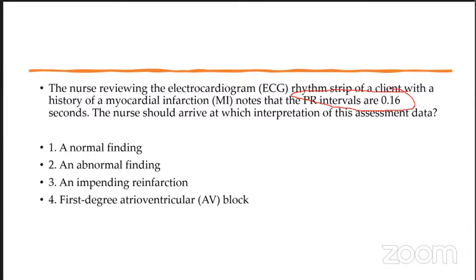A PR interval of 0.16. What will be your interpretation of this?